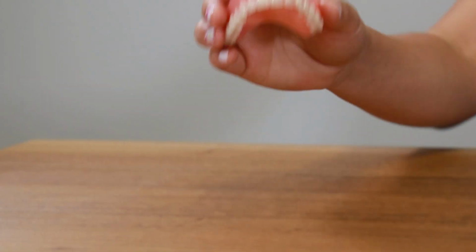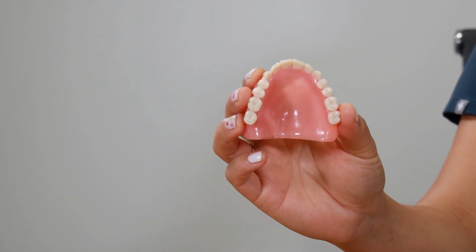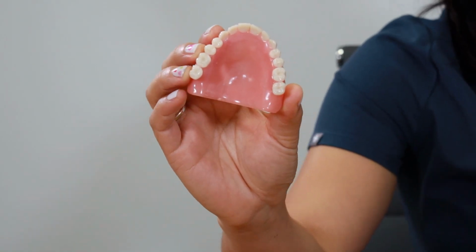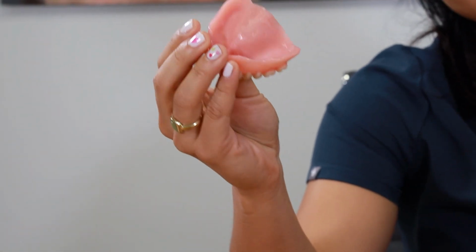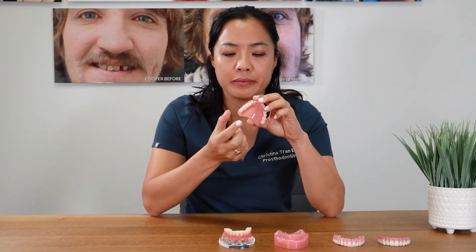This is a denture. It's made out of acrylic, which is a plastic. It's actually the same type of acrylic used to make acrylic nails, so it's not very strong. You can see it covers the palate. A device that covers the palate will affect taste. It will affect smell. A lot of what we think is taste is actually smell. So it's going to block all the receptors in your palate, and it sits on the soft tissue.